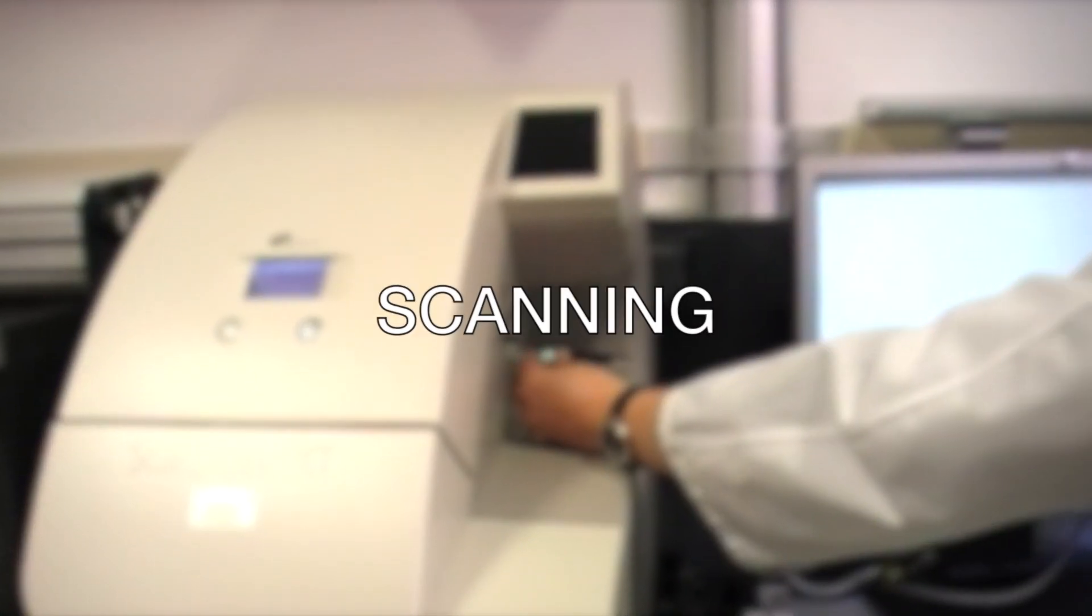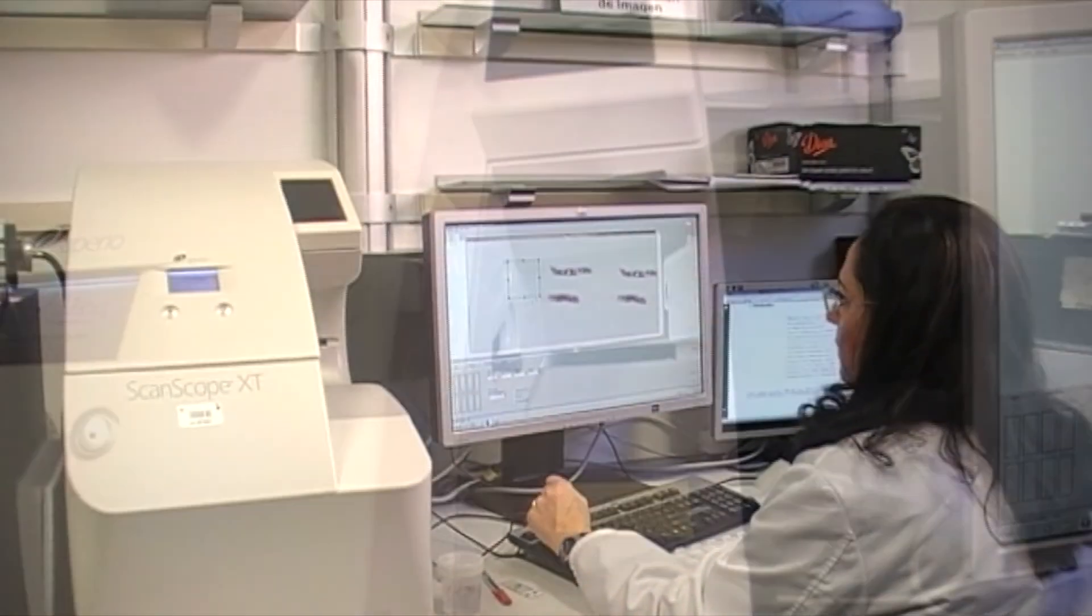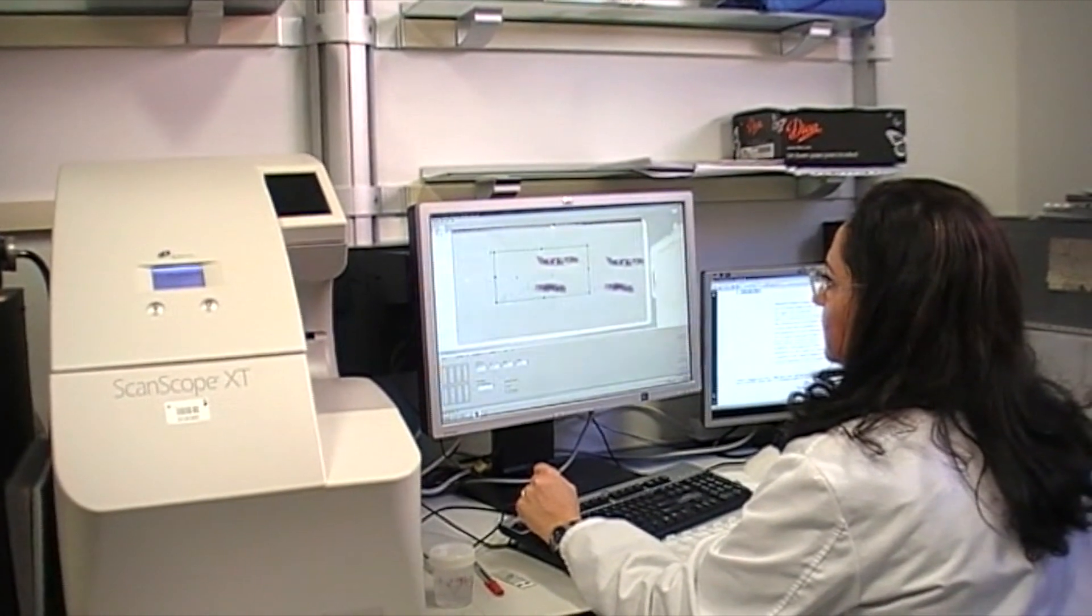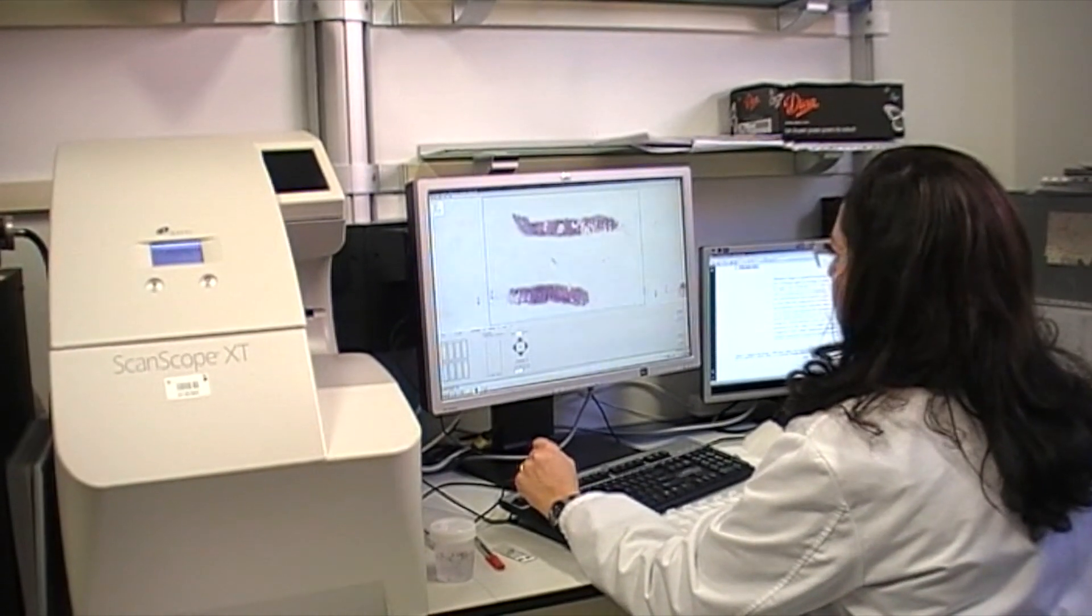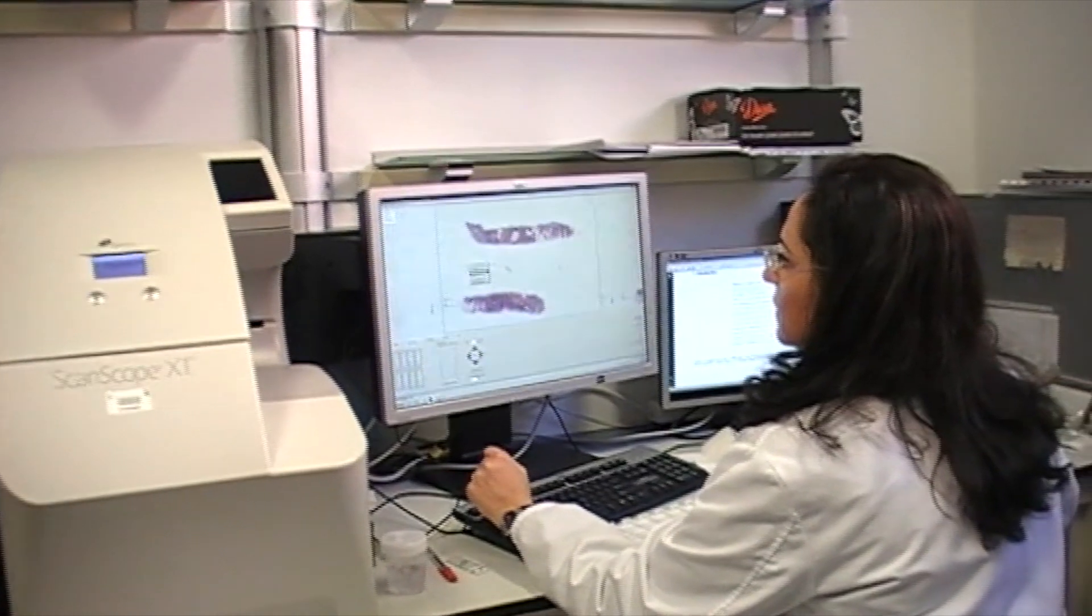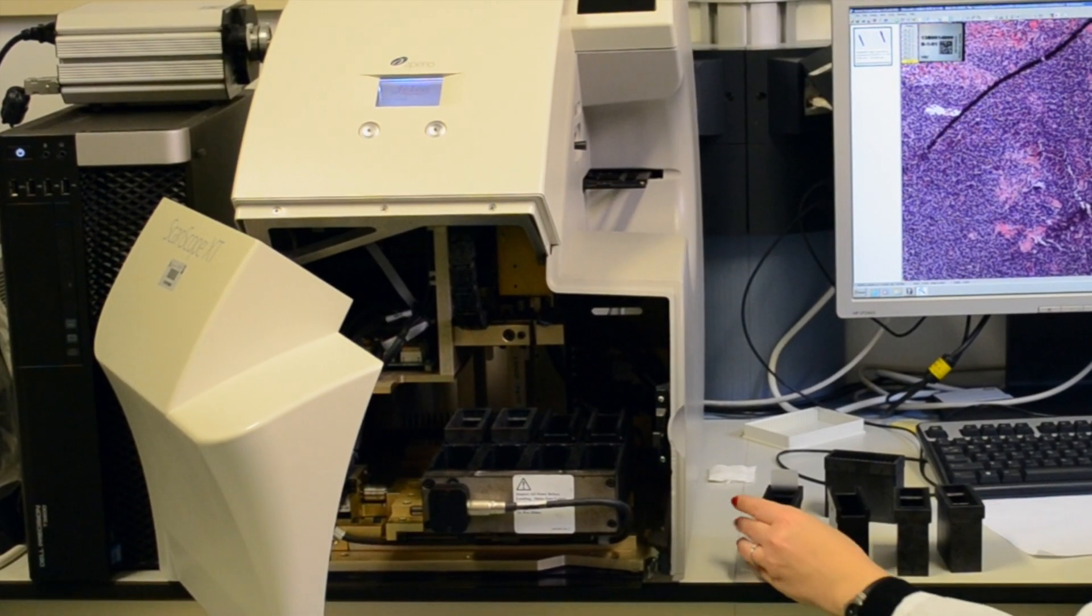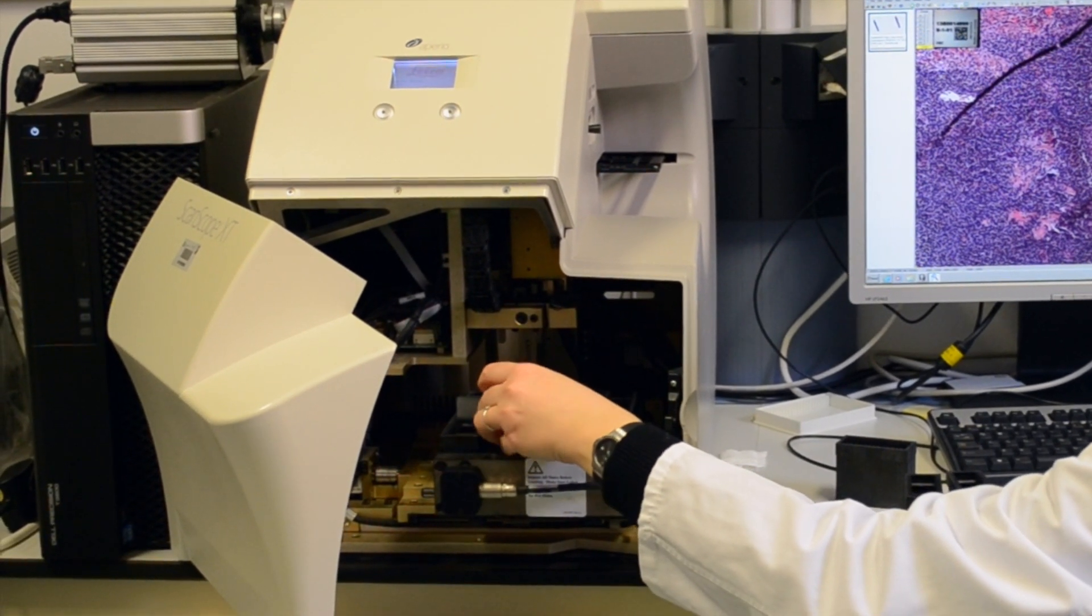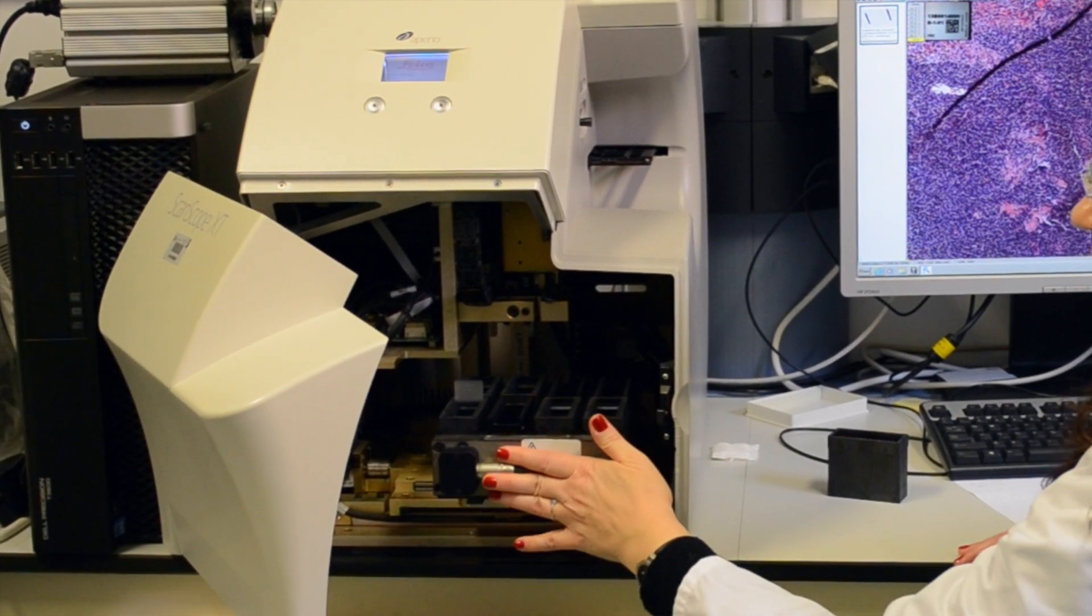Scanning. These slides can be digitized with digital pathology slide scanners. We can scan the whole slide and create the so-called whole slide image, or select an area of interest with a set of focusing points. This can be done manually to a single slide or automatically to an entire carousel of up to 400 slides. This enables pathologists to diagnose from a computer screen. Digital pathology is currently one of the most promising avenues of diagnostic medicine in order to achieve even better, faster, and cheaper diagnosis, prognosis, and prediction of cancer and other important diseases.